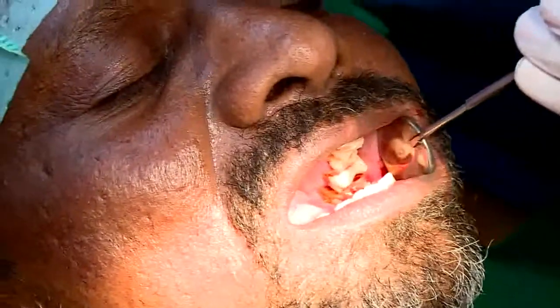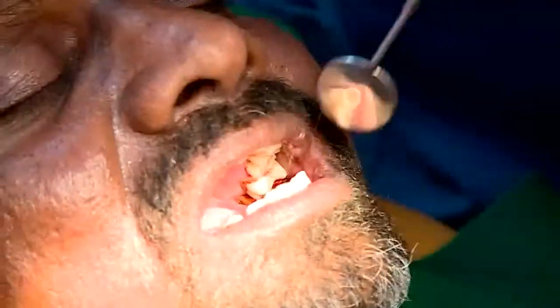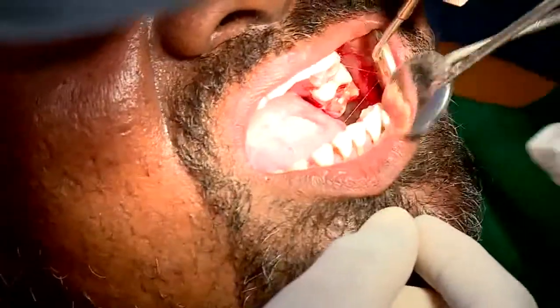For a vesiculobullous lesion like a pemphigus or a pemphigoid, I think you can take 2 tissues. One for a routine H&E sectioning and the other one for immunofluorescence studies. Okay, now we have seen that the biopsy is performed. We see a good defect there.